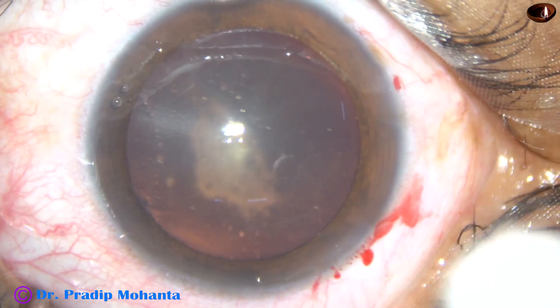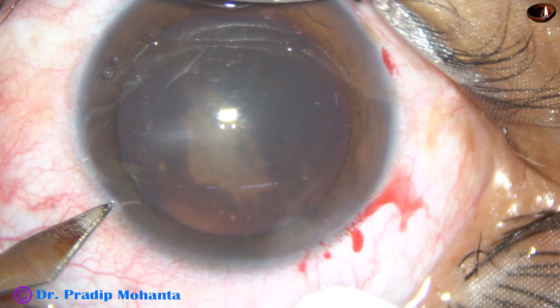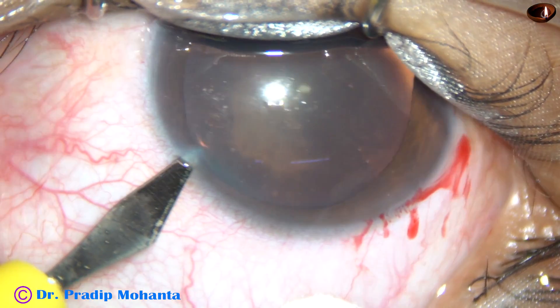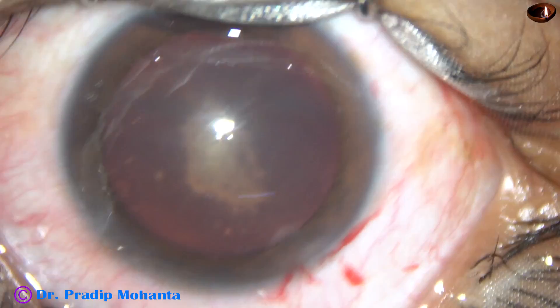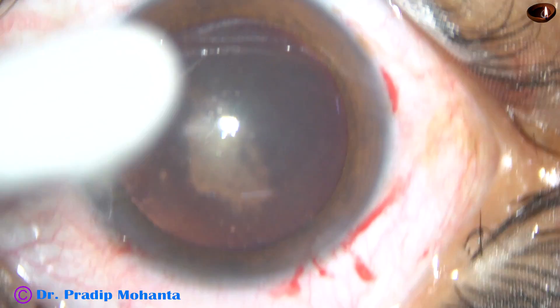By this time the main incision, the side port on the right side of the main incision, has been made, and this is another side port on the left side of the main incision. And now capsulorrhexis is to be done.